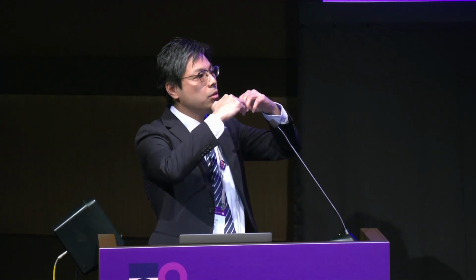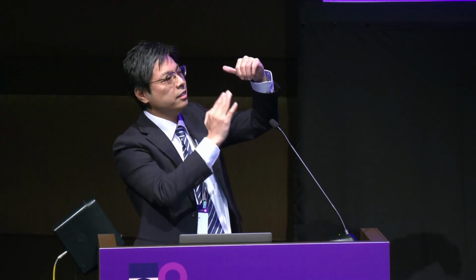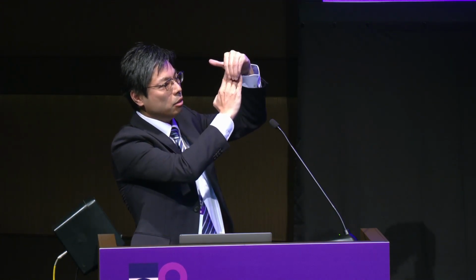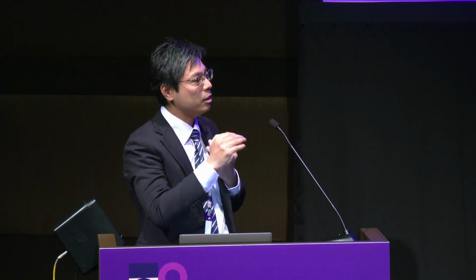Thank you, Paul. So I think that with symmetric tethering, we don't need to put the minus knob. Yes. But I think that in asymmetric tethering, we have to insert the arm between the posterior leaflet and the posterior wall like that. So that's why I think it depends on the position of the transseptal puncture. But I think that if we puncture mid or inferior, we have to put the minus knob.